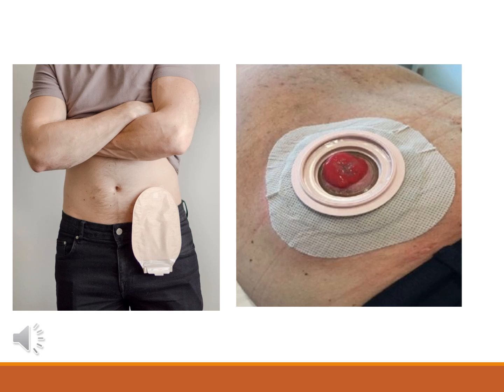Patients are responsible for changing their own bag as well as maintaining proper stoma care. If patients are in a hospital, they may require the help of a nurse or a medical assistant to help them with the changing of the bag.